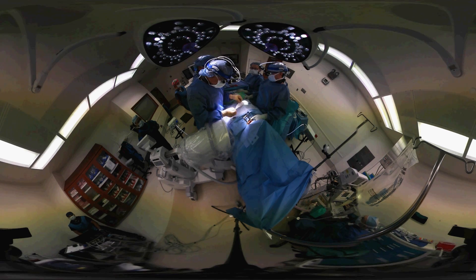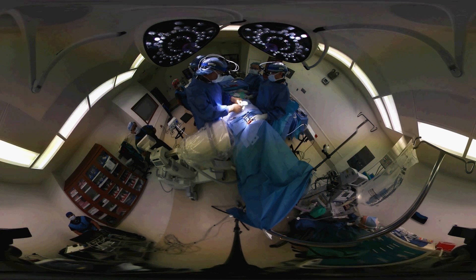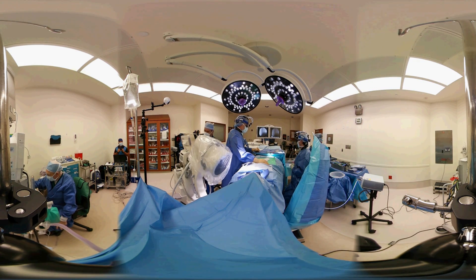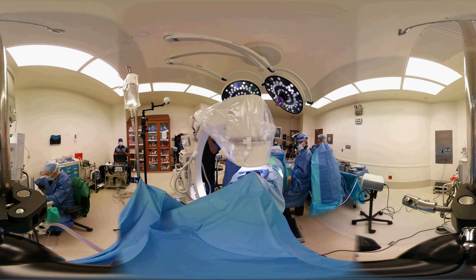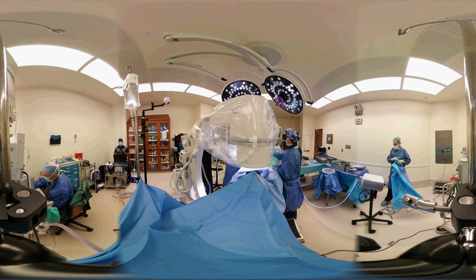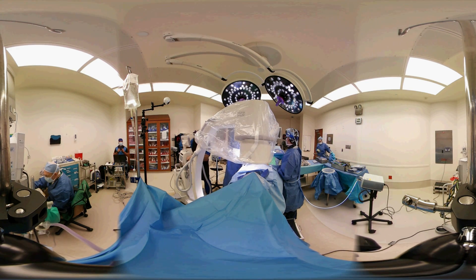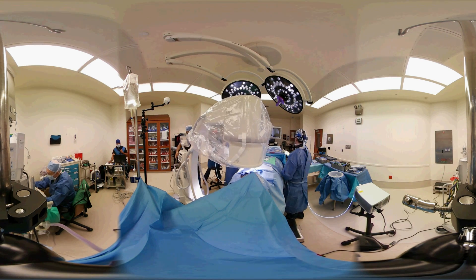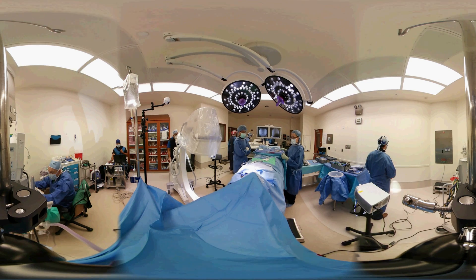We absolutely want to close the wound when it is dry, meaning no oozing of any blood — so this is a very important part of the step. Now we're moving the x-ray machine and we're going to check what we call an AP, an anterior-posterior view — the view as you would stand facing yourself, looking in a mirror. This determines if I like the position and if it's centered properly. The x-ray tech takes the picture, we inspect it, and we make a determination that we like the position — it's exactly where I want it to be placed.